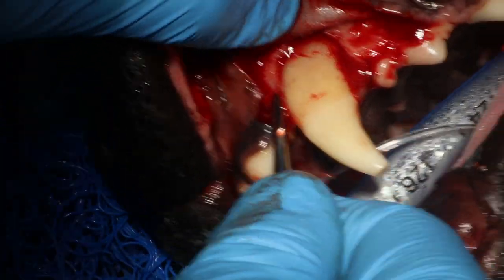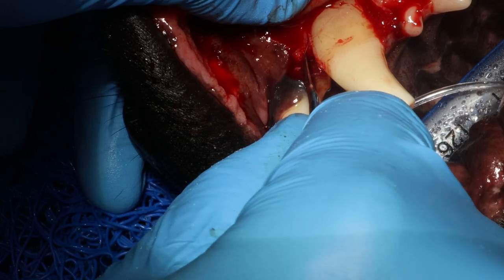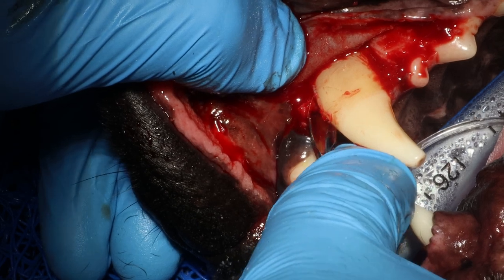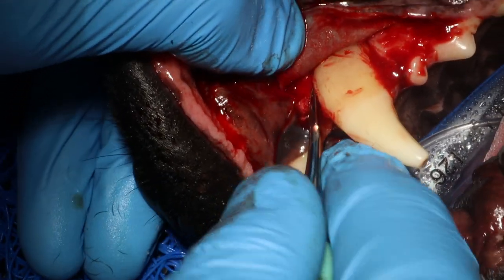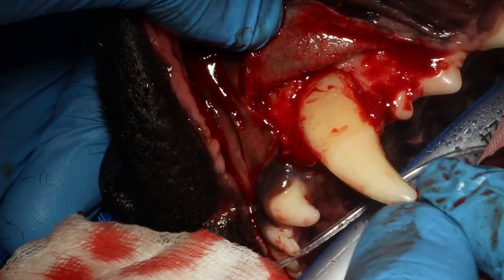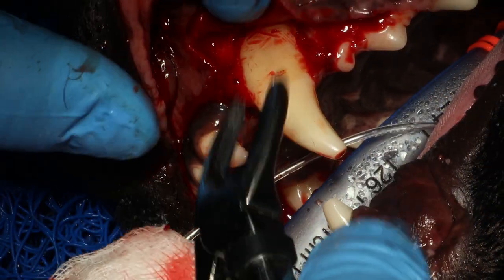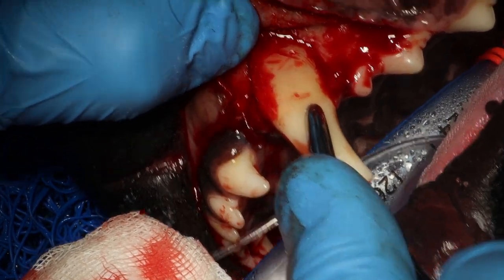The tooth is now quite loose — I just want to get it a little more loose. And then you want to twist and pull to remove it.